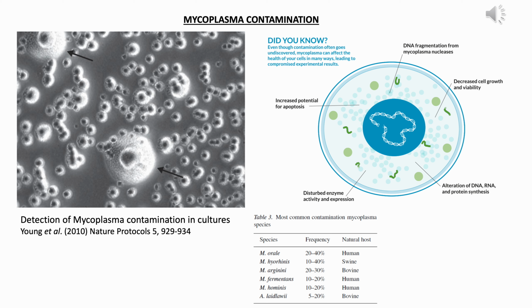One thing I have to tell you is that yellowness of the media does not always mean that there is contamination. If you fail to passage cells in time, if the cells become overconfluent, then also they exhibit yellowness.